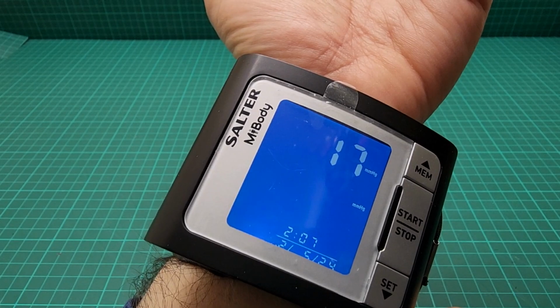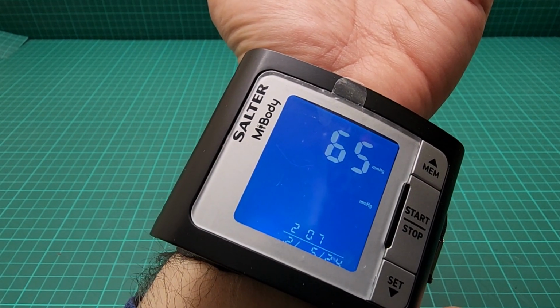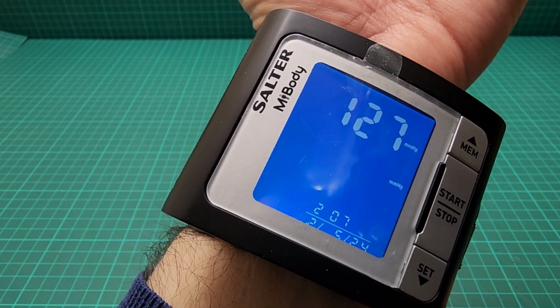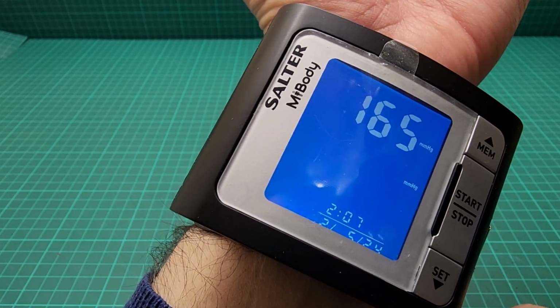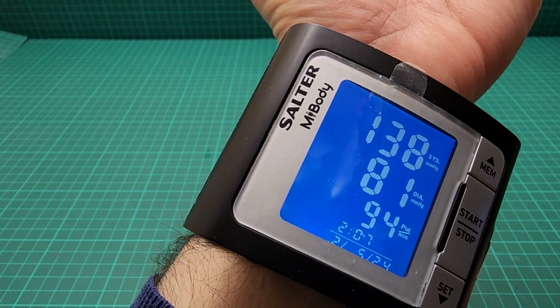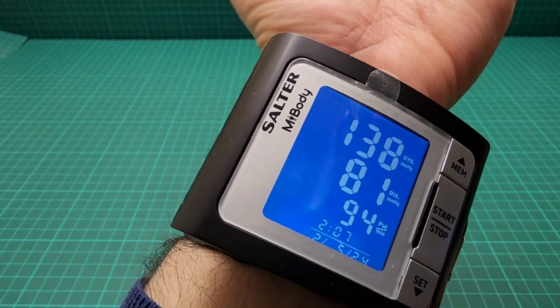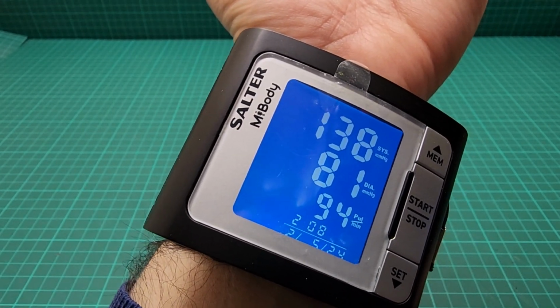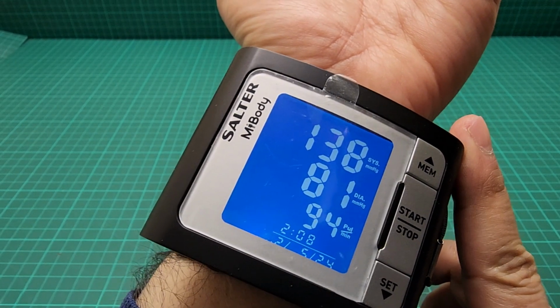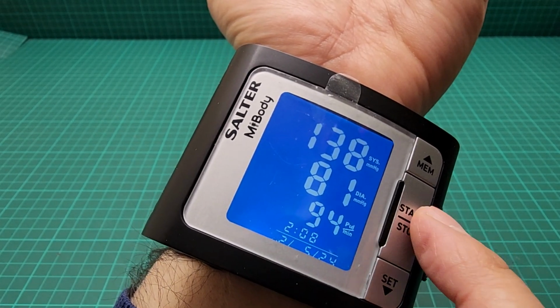The price of this unit is between £20 and £35. It depends on the specifications, but this one you can purchase even under £25. So bear in mind that you have to place this level with your heart and 2 centimeters above your wrist and hand, and while you are doing this, you have to stay quiet. You shouldn't immediately take your blood pressure after eating or drinking tea or coffee, and you have to be at rest. Anyway, this blood pressure reading is a little bit more favorable, and I'm a little bit excited doing this. This is the time and date, but I haven't set any of those precisely.